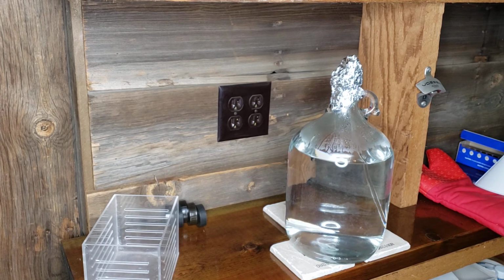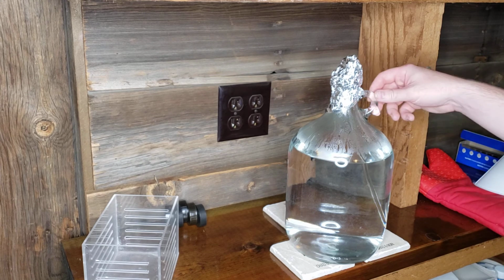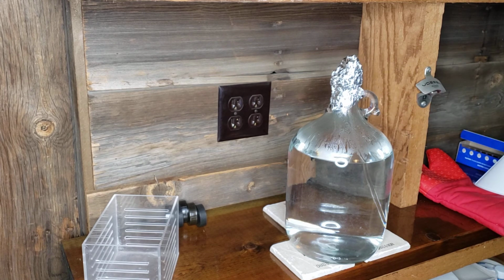I'll go ahead and bring this over to the algae room, sit on the floor. It's concrete floor so I can pull some of the heat out. Let this sit for 24 hours until it's room temperature, and at that point I'll be adding the fertilizer and add the algae. So I culture Rhodomonas, T-iso, and Nannochloropsis.